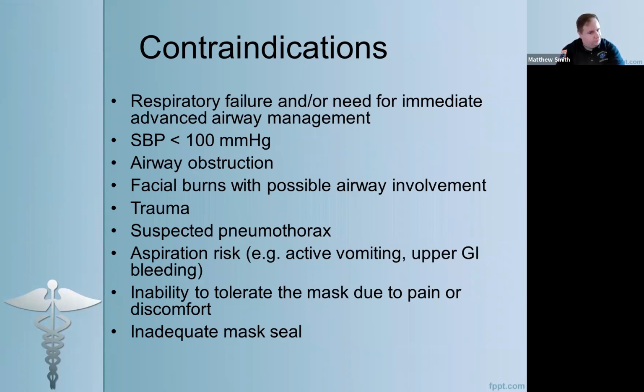Airway obstruction, CPAP could potentially make the airway obstruction worse. When we talk about airway obstruction, they're talking about foreign body airway obstruction. They're talking about vomiting. They're talking about maybe blood, something we would need to suction out. And so again, because CPAP reduces our ability to assess and treat those problems, then we can't use it. In terms of lower airway obstruction, that is actually an indication for using CPAP. So very clearly here, when they talk about airway obstruction, they mean the upper airway.